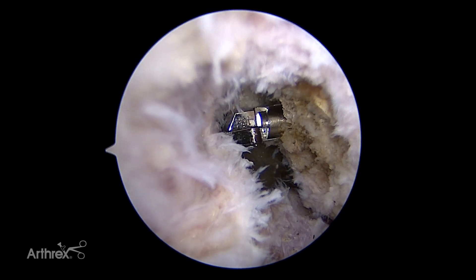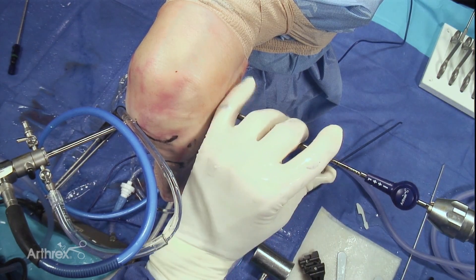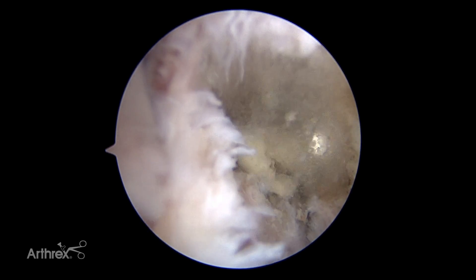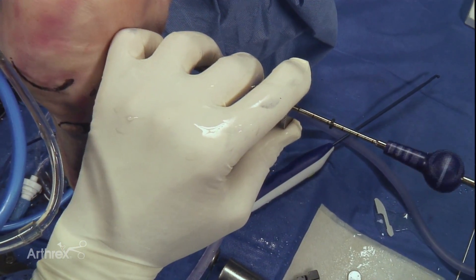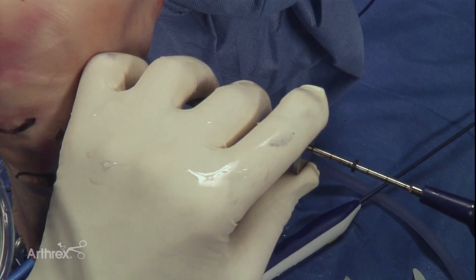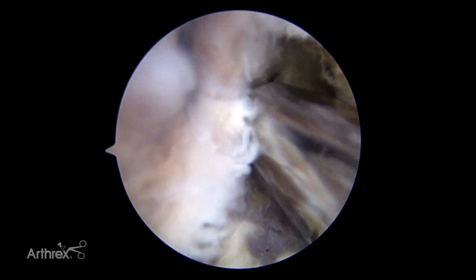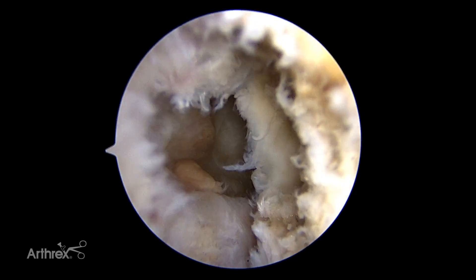We can see the number — 10 millimeters — and now I've flipped it down. I'm looking at my grommet on the exterior view so that I can measure the socket length, because that is important. Now I'll start reaming. Sometimes I'll start slowly at first to avoid any compromise of that roof. Now we're at 10, 15, 20, 25 — about 28 millimeters of socket depth before I hit the metal sheath. We'll rinse this out a bit. The flip cutter is now in the straight position; I've removed it and I'll place a fiber stick into that position.